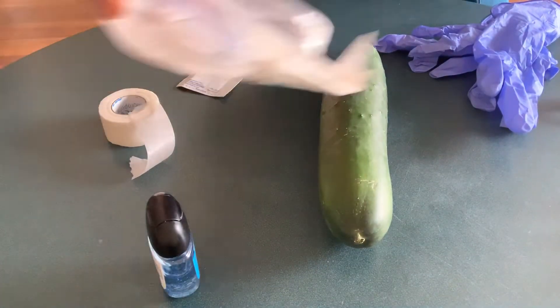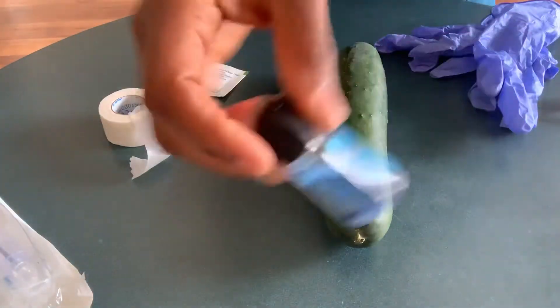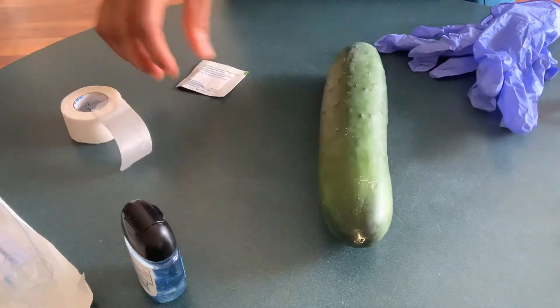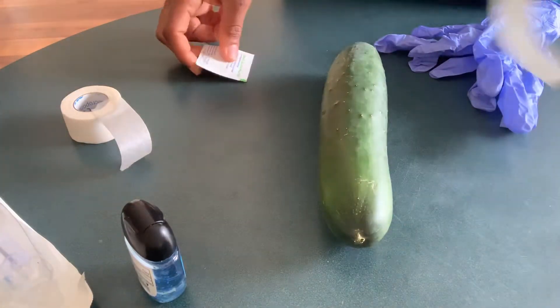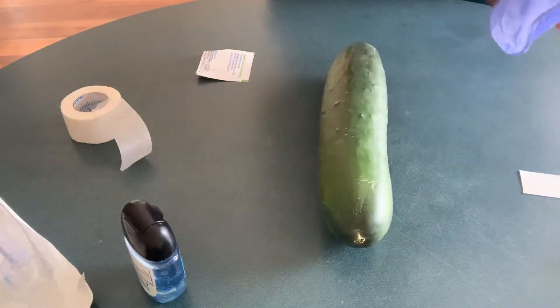So here with me is my butterfly needle stick, this is my hand sanitizer, this is my adhesive tape, this is alcohol wipes, my tourniquet and tubes for blood collection, and my gloves.